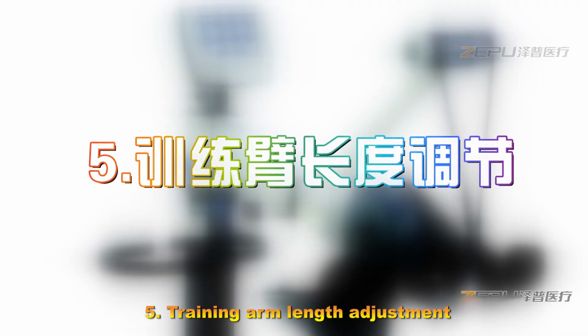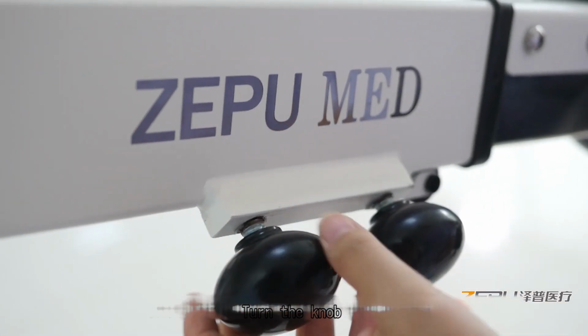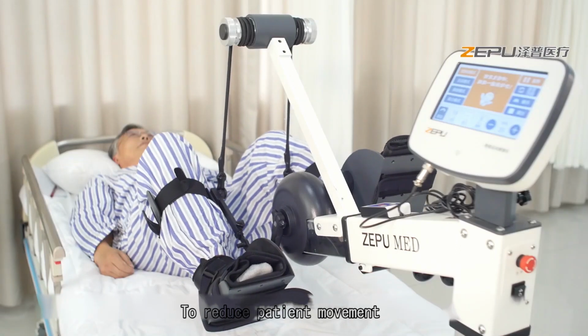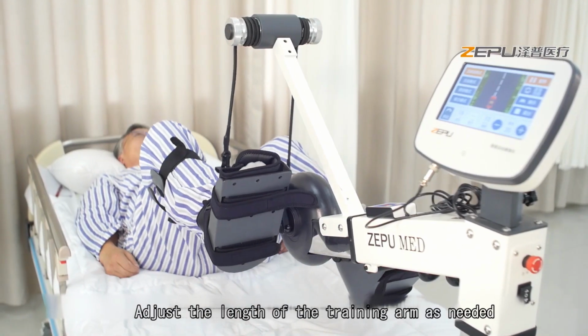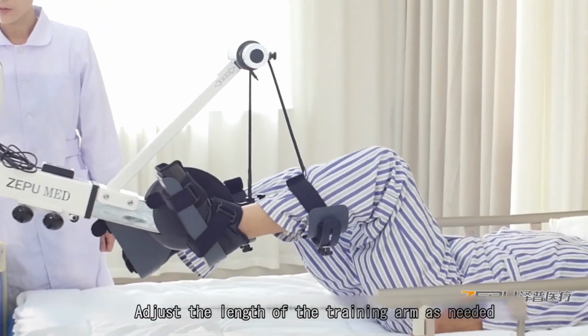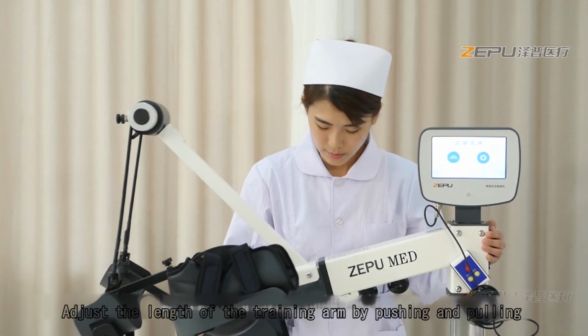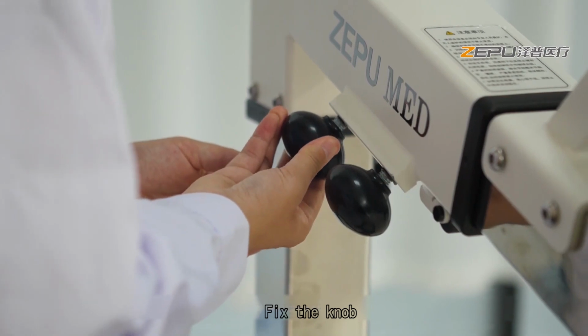Five, training arm length adjustment. Turn the knob according to the patient's height or lying position, to reduce patient movement. Adjust the length of the training arm as needed by pushing and pulling. Fix the knob.